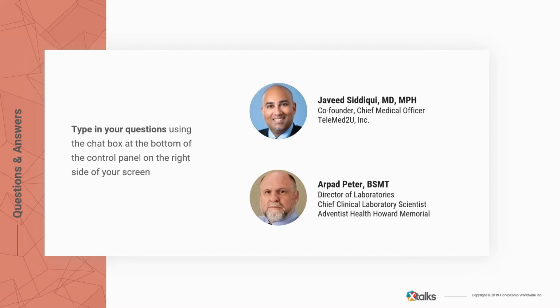Yeah, and I'll tell you my view. Don't. I think if we have any questions, and they're typically questions when things are negative. That's an example. When things are positive, they already call Dr. Siddiqui. But when things are negative, we basically have to explain that it doesn't cover something that the targets don't cover, and so in that particular case, we'll also refer them to Dr. Siddiqui.